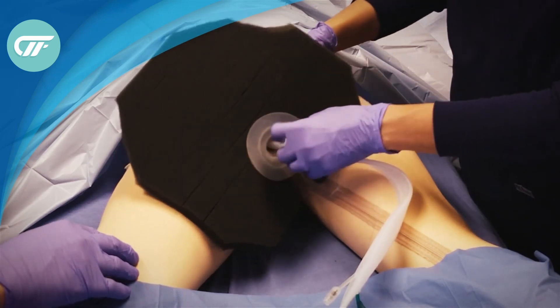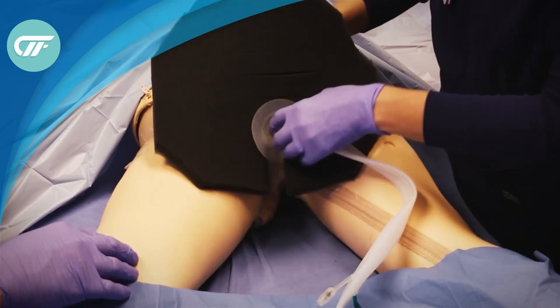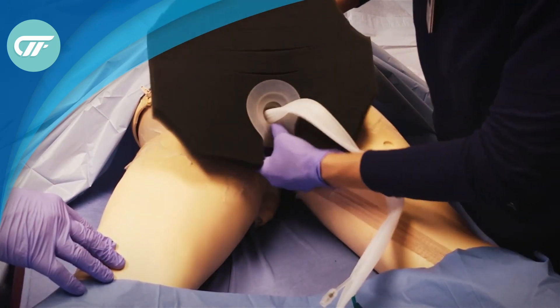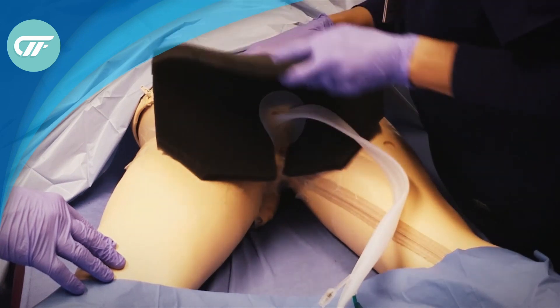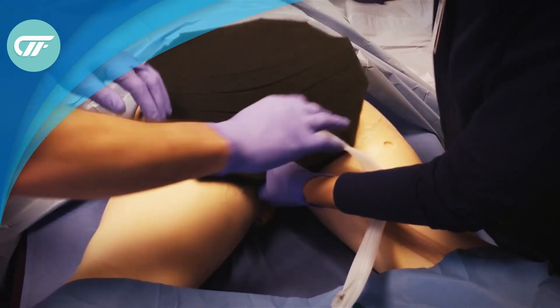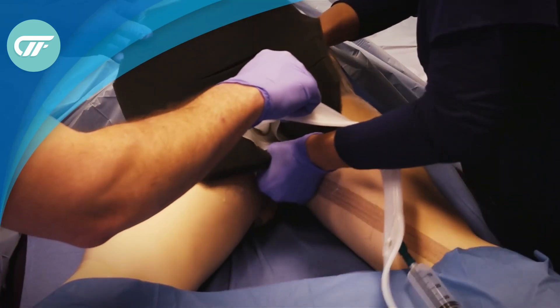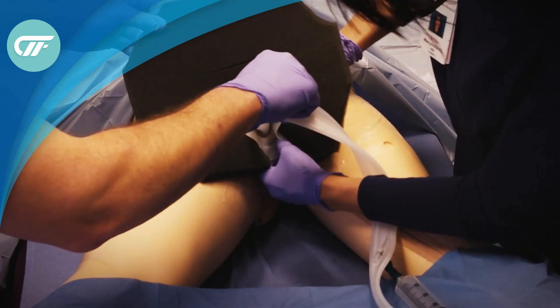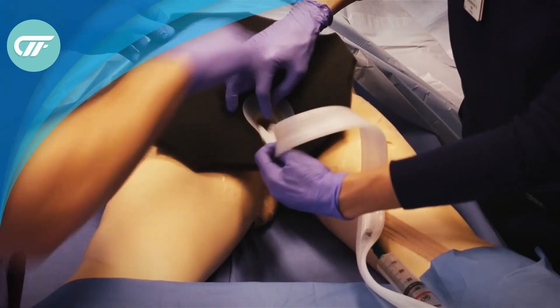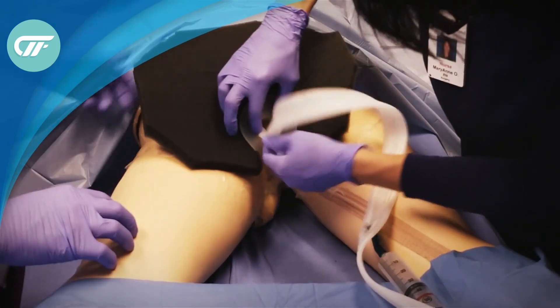Then you snug the fistula funnel up to the rectum. Sometimes holding the fecal management system tight can help to place the funnel in the right direction. Once the funnel is in place, you definitely want to look at your fecal management system and make sure it's straight.